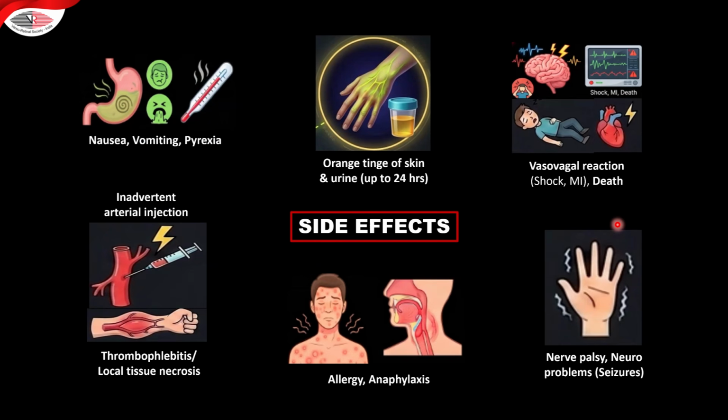Rarely, there could be an anaphylaxis or a milder allergy to it, and so you should always be prepared to take care of that, or a vasovagal reaction, which can cause a shock or an MI.